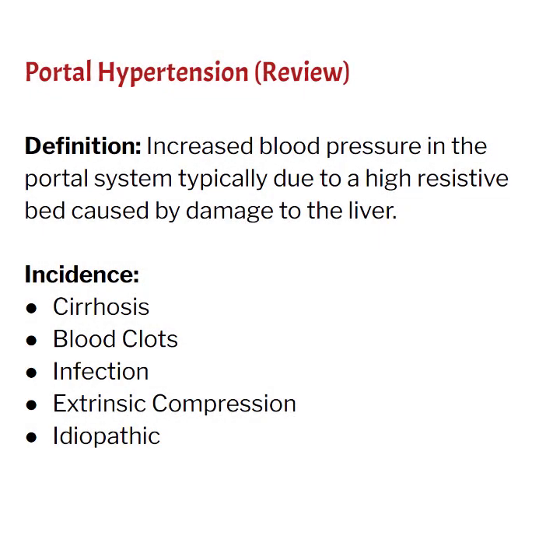We already covered portal hypertension pretty extensively in the hepatic pathology lecture. So this is going to serve more as a review for these first few slides, and then we'll delve a little bit deeper into the hepatic Doppler protocol.